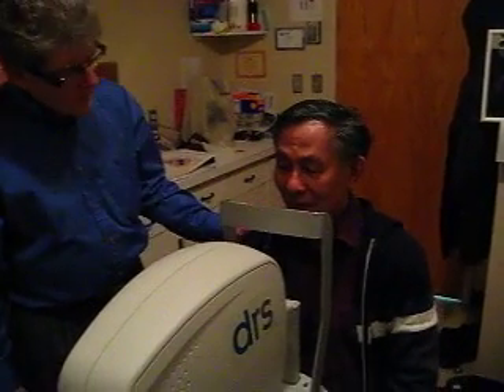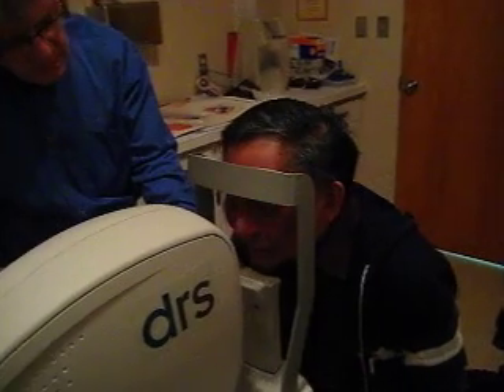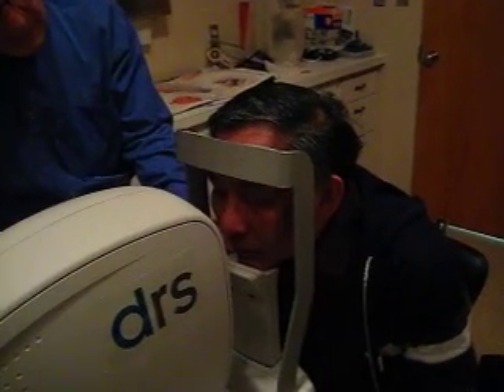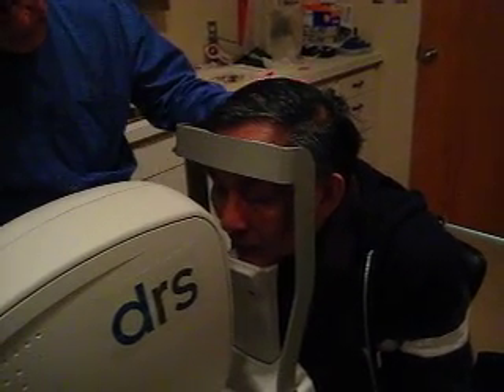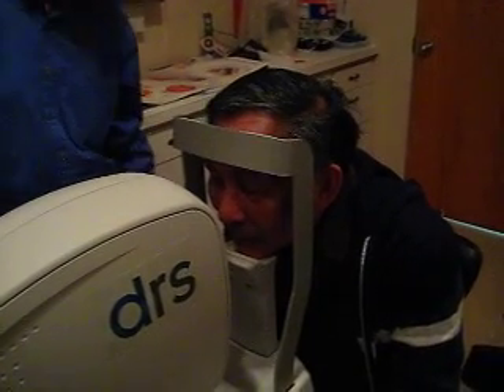Okay, so Mr. Kui, what we're going to ask you to do is to put your chin on the chinrest here. On the chinrest, you're going to hear a click. There you go. As that click, it needs to hear the click. If you would just push down. Your forehead up against that. That is perfect.